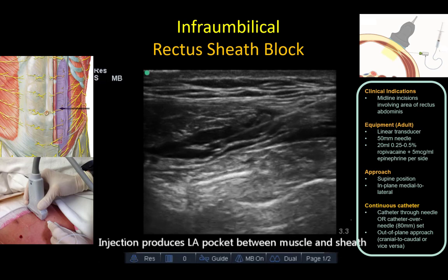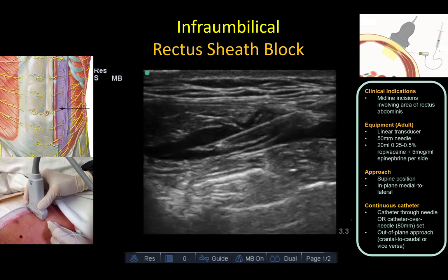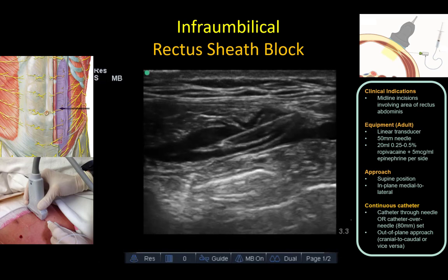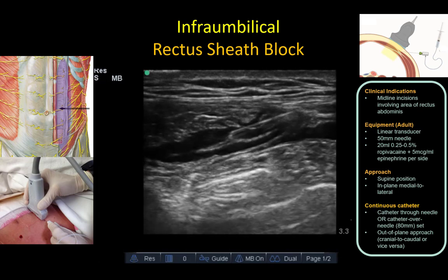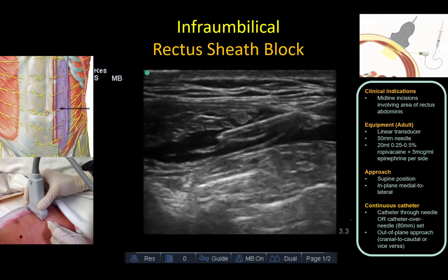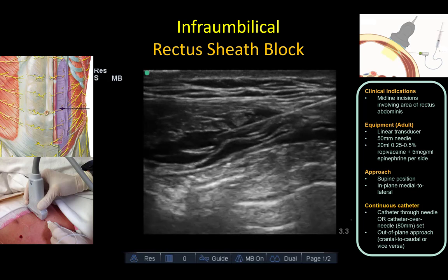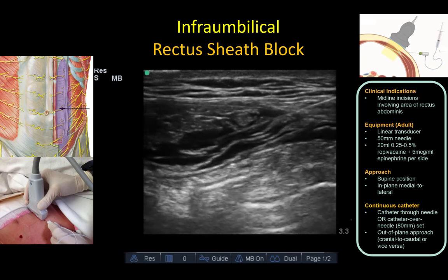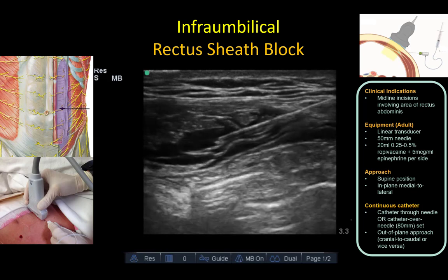The local anesthetic injection should travel towards the deep inferior epigastric artery in the same plane. Knowing this fact, we can see that the correct plane in this instance is actually one layer deeper than where the needle currently is, and it should be repositioned.